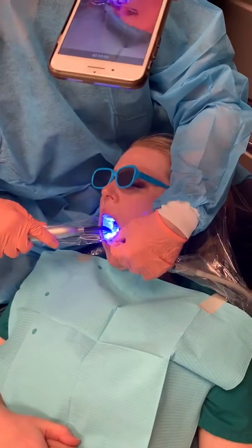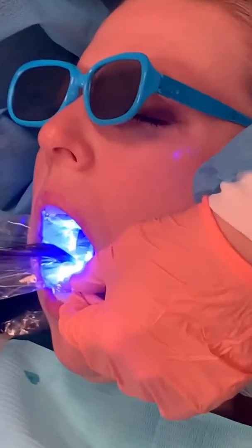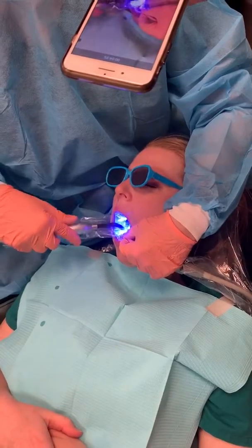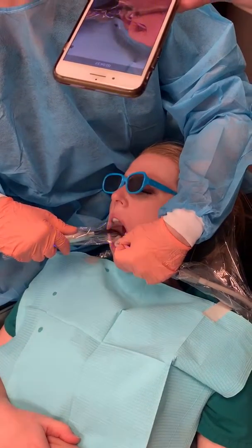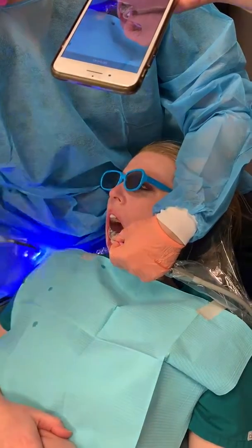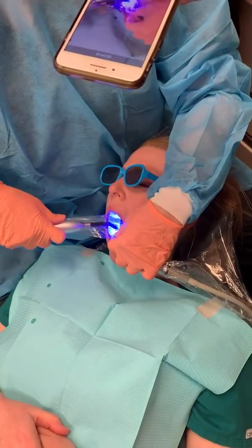And I'm going to cure. I don't have a shield — don't look at the light. I like to cure molars for a minute — that's just my personal preference. But regardless of what teeth you're doing, it has to be at least 30 seconds.